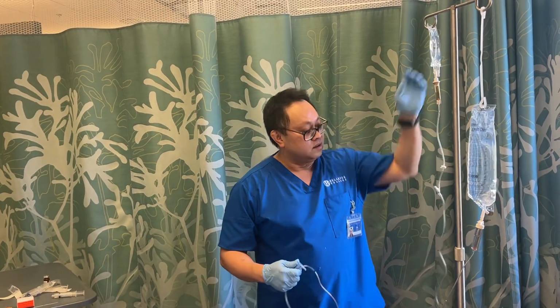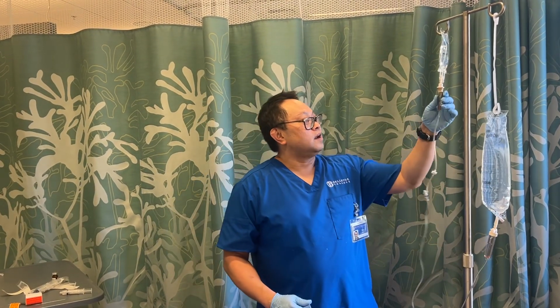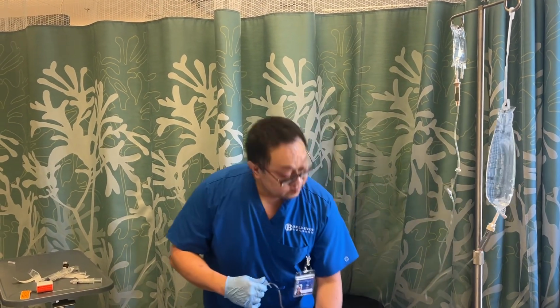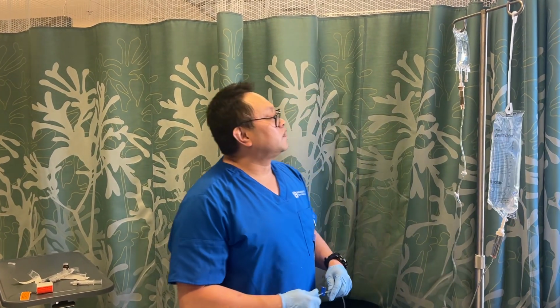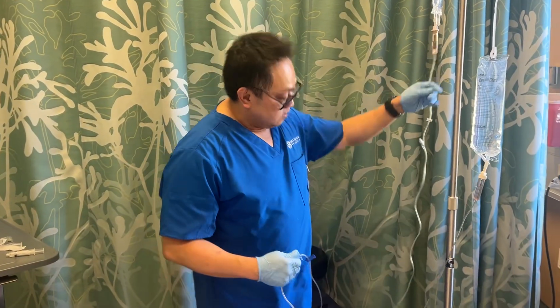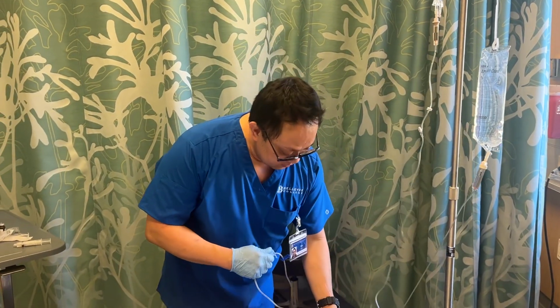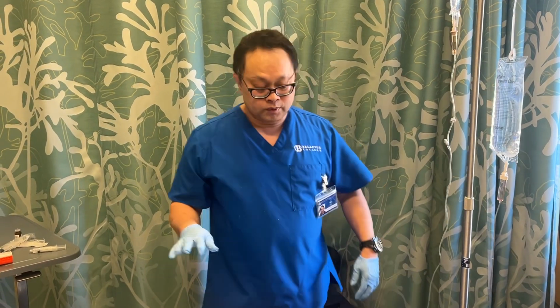All right. And again, this is old tubing, so it would be dropping at 44 drops per 20 seconds. Because this is flowing, okay, so great. It's 44 drops per 20 seconds.